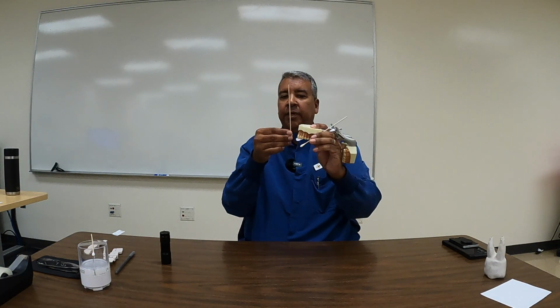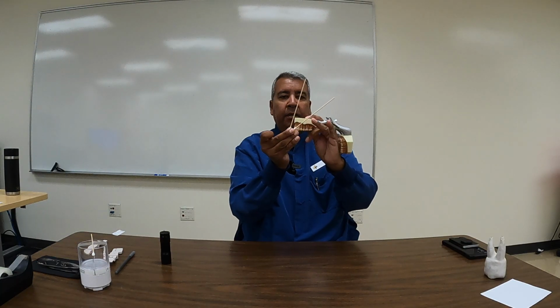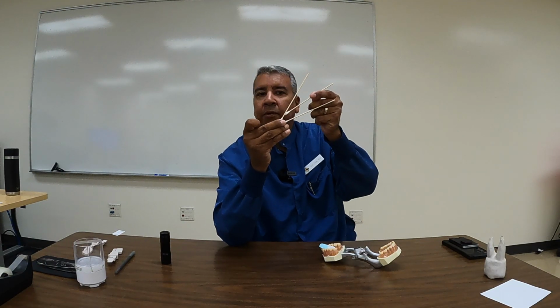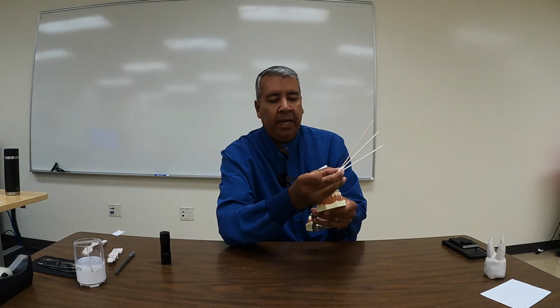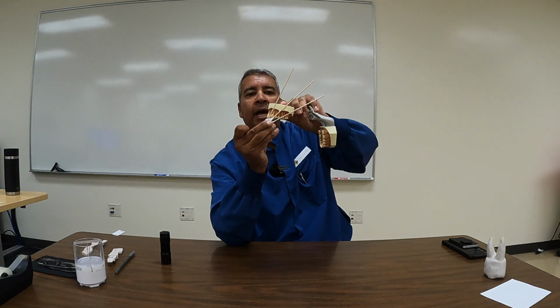Then the angle of these anterior teeth, they're not straight up and down. They have a little bit of an angle to it, don't they? So these two are coming in kind of like this. That is the angle of those two angles that we have. The angle of the tooth, the angle of the film. Okay, so where is the bisector? Is it on the outside of here? It is between those two. There's your bisector. So we can take this, I could put it back. As accurate as I possibly can, and then that is your bisector.